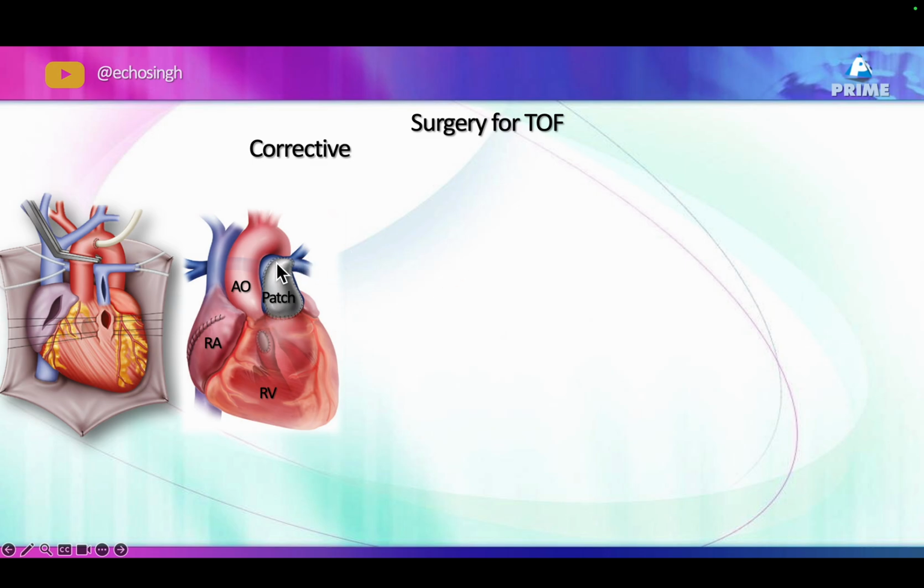And what is the requirement? Pulmonary artery size should be adequate. Pulmonary valve size should be adequate.